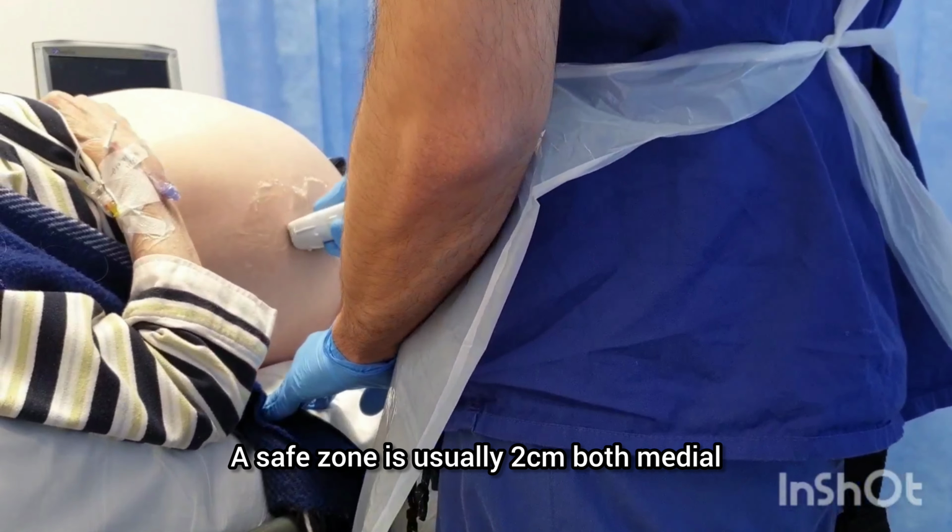You will have drawn up 10 ml of 1% or 2% lidocaine. You will start by injecting 3 to 4 ml superficially, creating a bleb using an orange needle. Then with a green needle, you will infiltrate your local anesthetic generously from the skin to the parietal peritoneum. You will stop, check, inject roughly every 2 to 3 millimeters, giving 1 to 2 ml each time till you reach the peritoneal space.